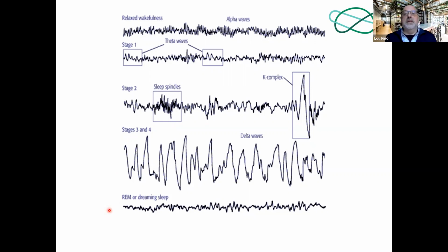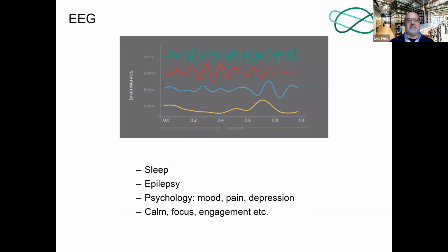Interestingly, the pattern of EEG while you're sleeping is very similar to when one is awake. So I find that very interesting, very strange. There's a lot of frequency information in EEG.